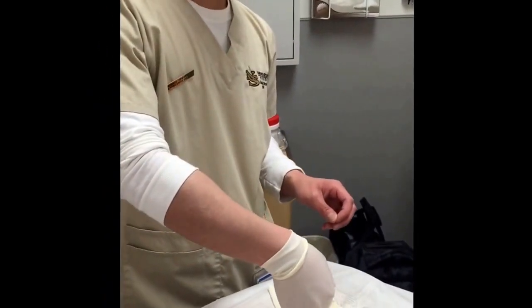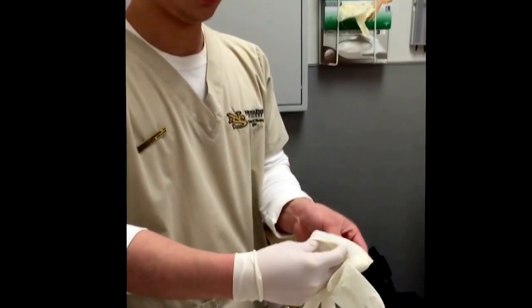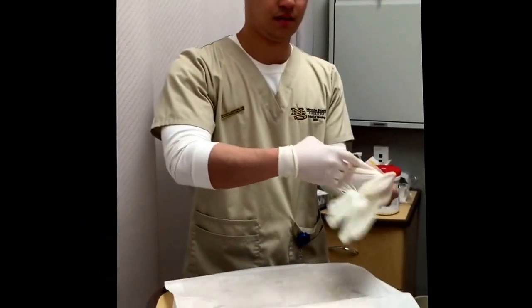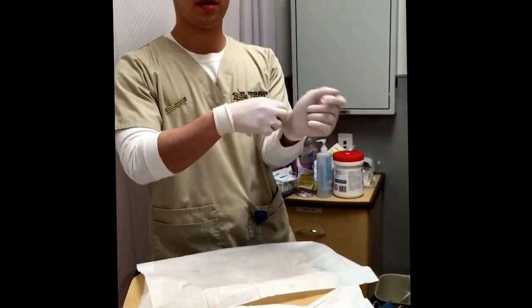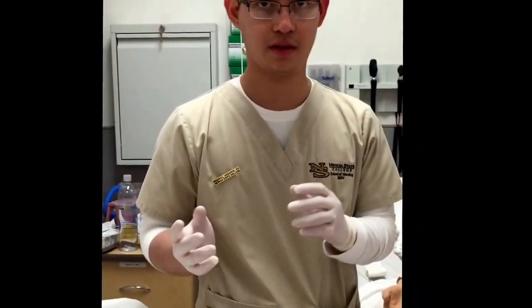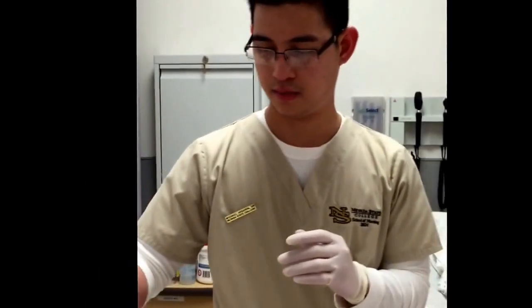Make sure you're not contaminating the gloves. You were kind of looking at me, and you're like, oh, did I forget something? So I was like, okay, we're done. I was just waiting for you. Make sure before you do the catheter that you assess your patient, check for discharge, check for any bleeding or any discomfort on the abdominal area, and make sure that you've done perineal care for her before the procedure.